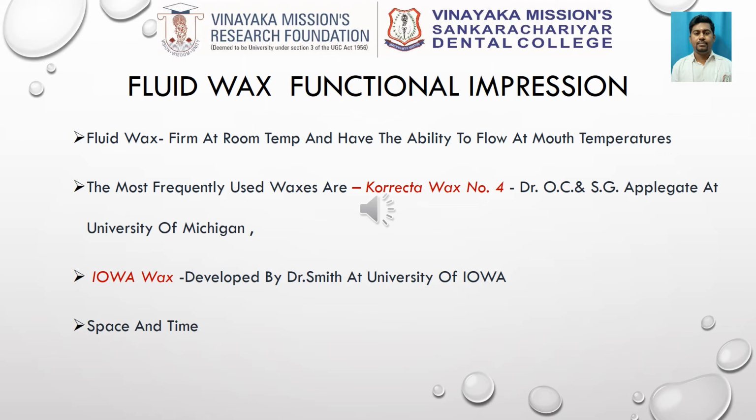This is basically done with the help of an open mouth technique so that there is less danger of over displacement. The unique quality of a fluid wax is that it is firm at room temperature and has the ability to flow at mouth temperatures. You have to understand that this is according to ADA specifications, where the room temperature is quite low in the Western countries compared to the mouth temperature.